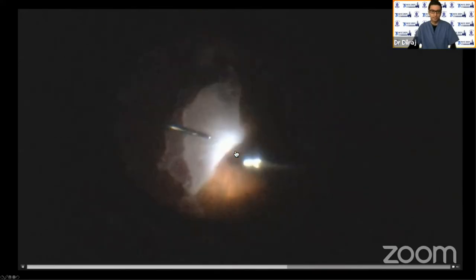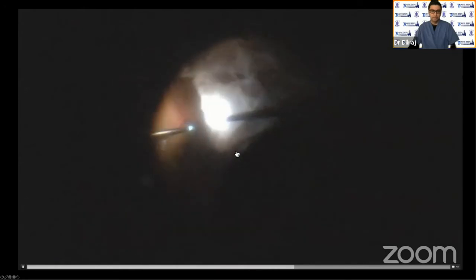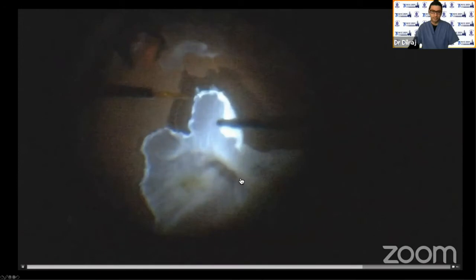One of the things I wanted to highlight in this video is that we went ahead and performed a 360-degree retinectomy. This is something that you want to avoid before you have stabilized the retina, and you'll see why in just a minute. As we're trying to place perfluorocarbon now, we're struggling with getting that to lay over the retina, and in fact, the retina just slides over to the side. Part of the reason for that is that the posterior funnel of this residual retina is still not open. So there's a lot of intrinsic contraction there.